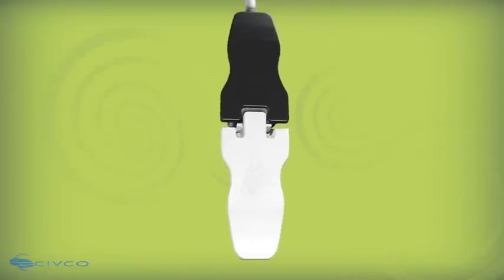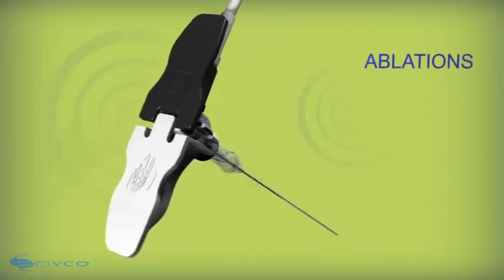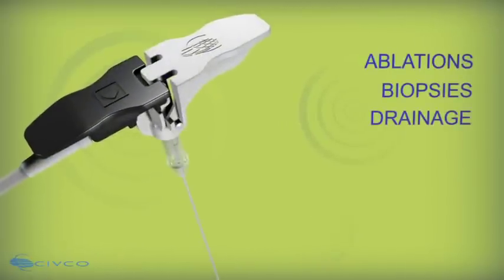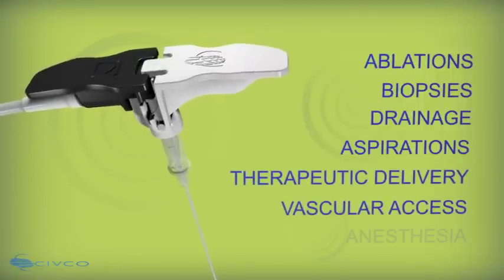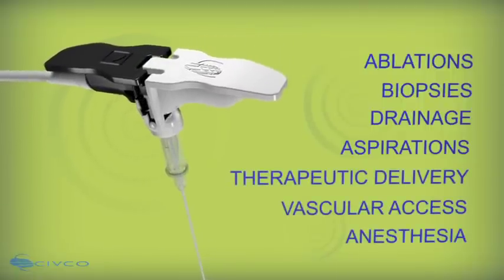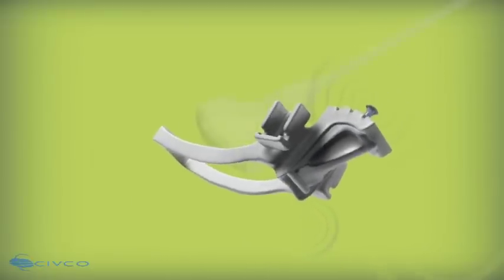Civco's electromagnetic tracking system may be used with devices for applications such as ablations, core tissue biopsies, drainage, fluid aspirations, therapeutic delivery, vascular access, and regional anesthesia. Assembling the Civco tracking bracket system together is easy.